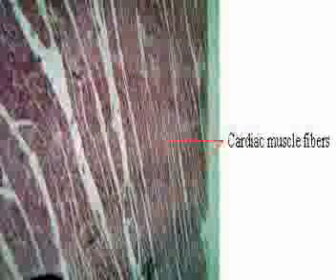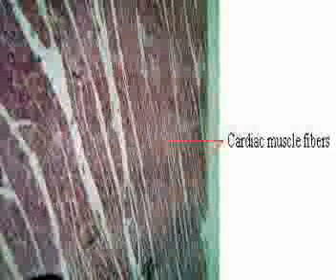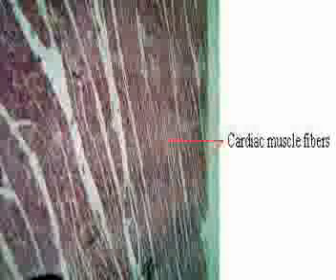Cardiac muscles are identified by their intercalated discs, which are usually prominent in longitudinal sections. Differential diagnosis. Muscle fibers can be confused with each other. Striated muscles have obvious striations, both transverse and longitudinal. Smooth muscles are devoid of striations, while cardiac muscles have intercalated discs as their identifying feature.